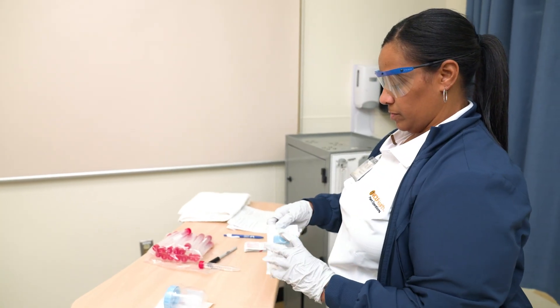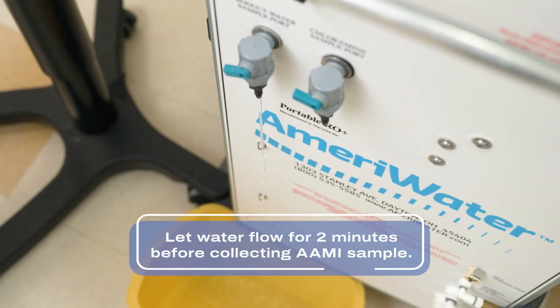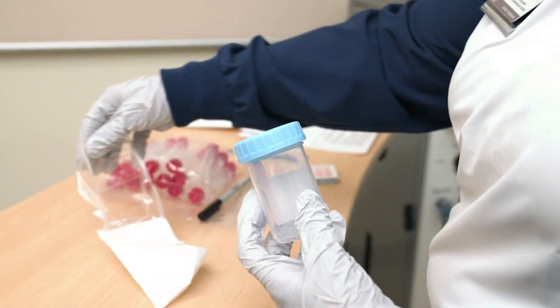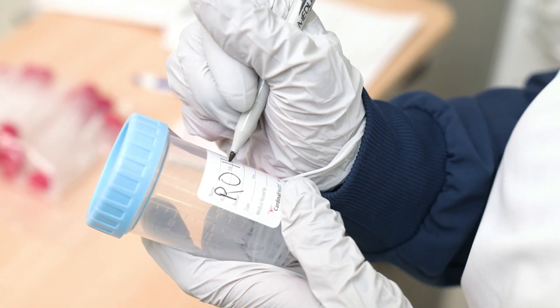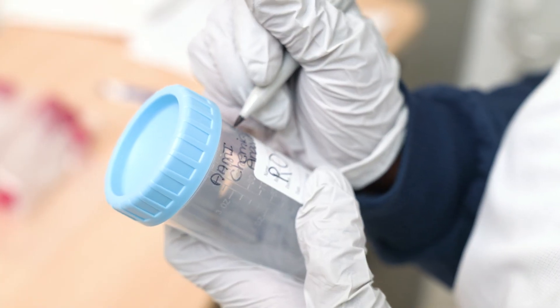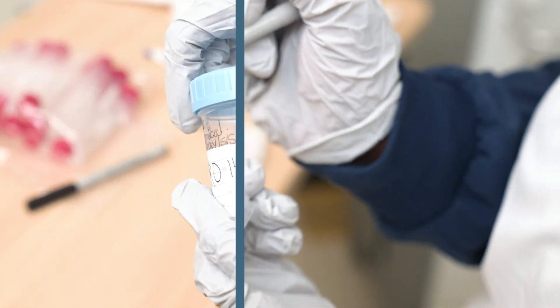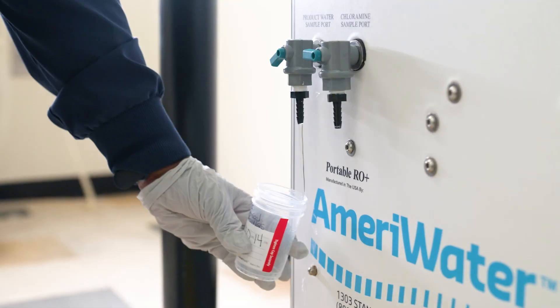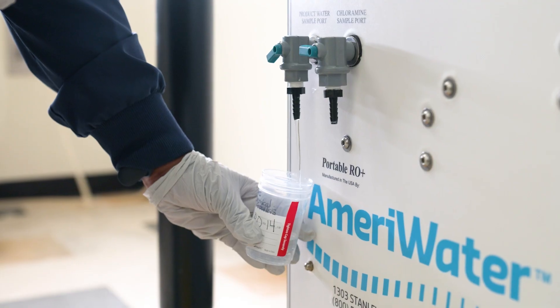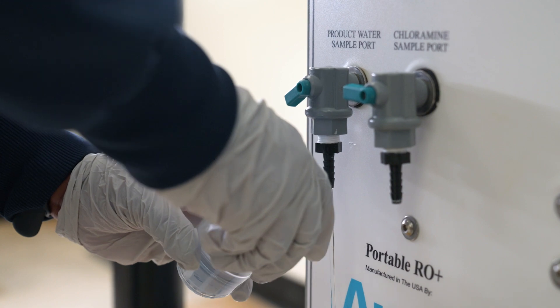Next, we'll collect the sample for the AAMI chemical analysis. Before collecting this sample, the water must have run for at least two minutes. Take your sterile sample cup and label it with the name of the RO machine. Additionally, write AAMI chemical analysis to signify what tests the sample will be used for. Remove the cap and, using the clean catch method, retrieve your sample, filling the cup entirely. Replace the cap, turning it upside down once to ensure it's not leaking.